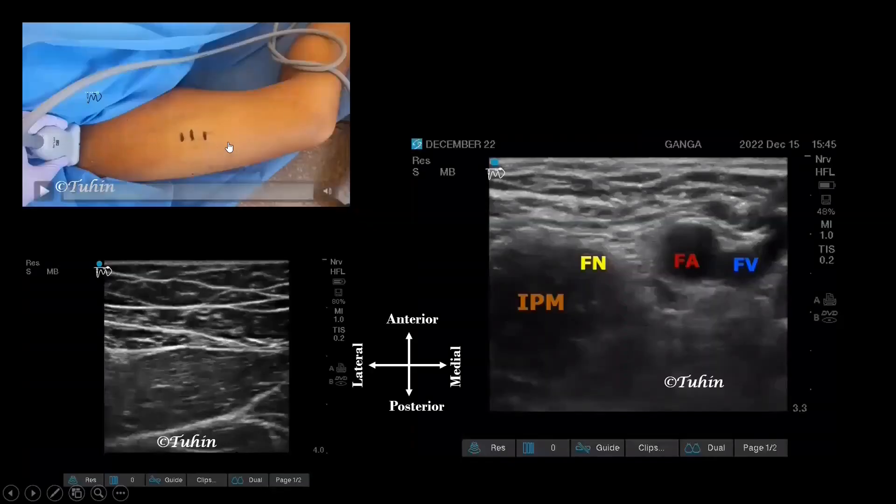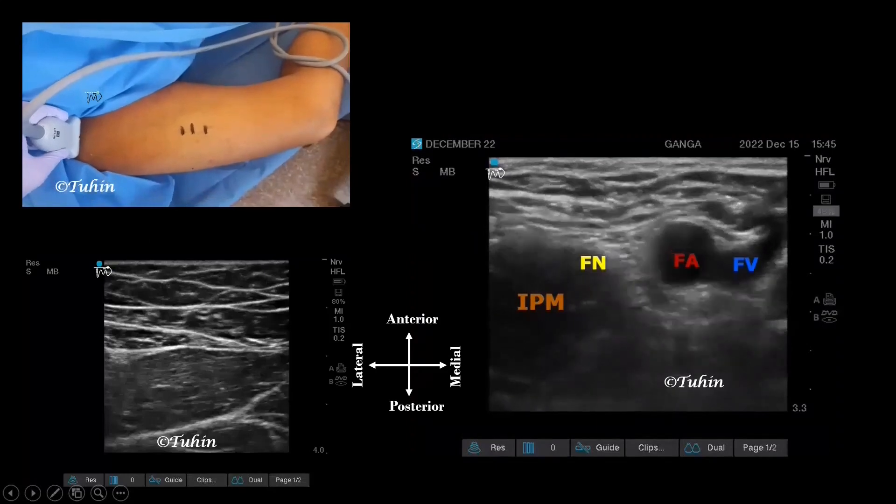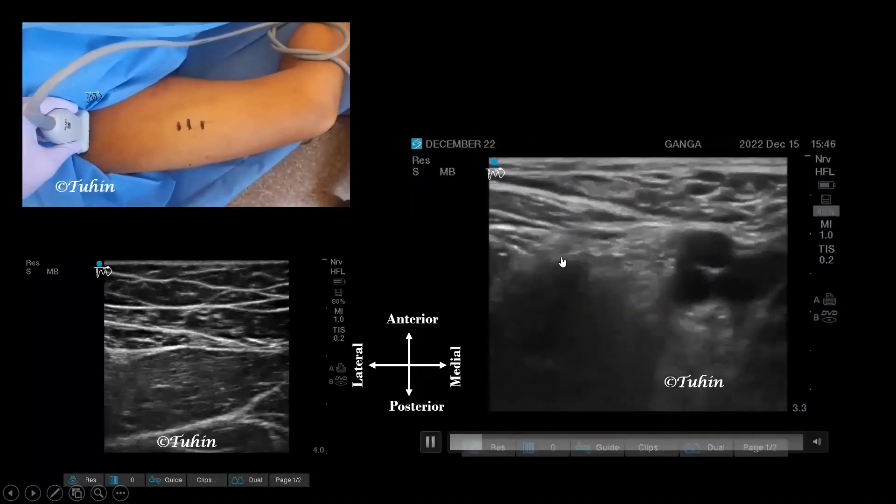As you can see, I have marked three points on the anteromedial aspect of the thigh. The first corresponds to the distal-most part of the femoral triangle, the second is the apex of the femoral triangle, and the third corresponds to the proximal adductor canal. You can directly place the transducer over the anteromedial aspect of the thigh and look for the sign of three, or you can start scanning from the inguinal region by identifying the femoral vessels and femoral nerve.